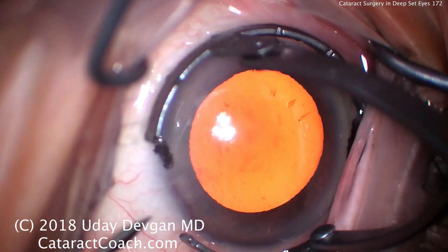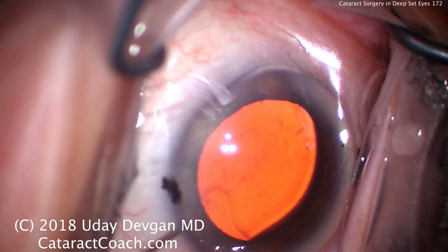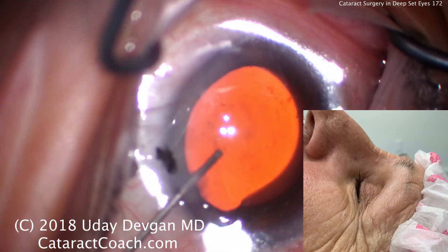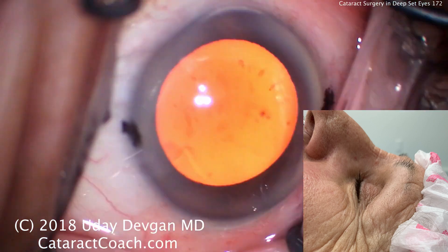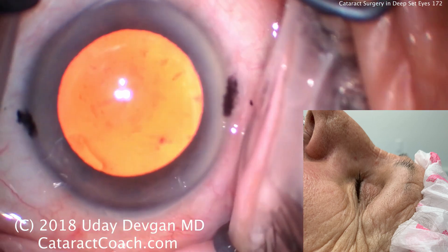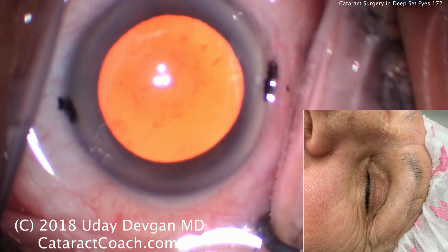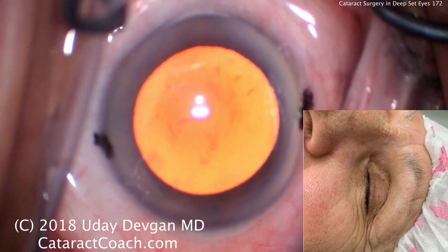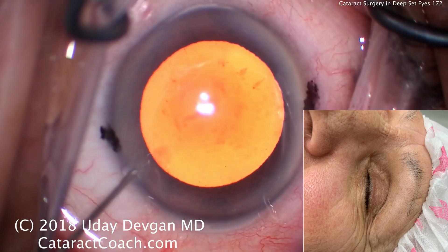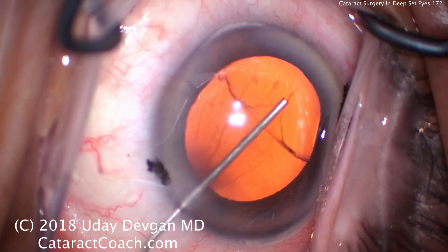We'll make our paracentesis. You can also see that the position of the eye — look where the corneal light reflex is. It's not in the center of the cornea. And now look at the tear film, look at all the pooling of the fluid there. So let's try to adjust the patient's head. Again, we want the corneal light reflex in the center of the cornea. There's that Purkinje image of the microscope lights. Still, though, there's a lot of fluid on the surface of the eye.